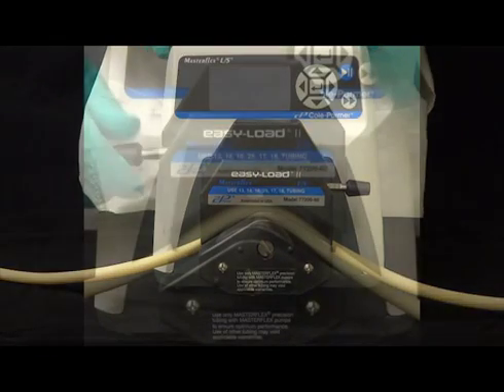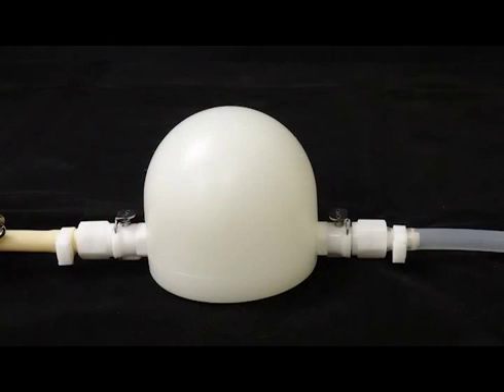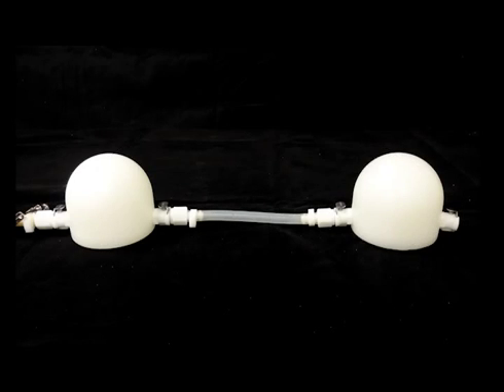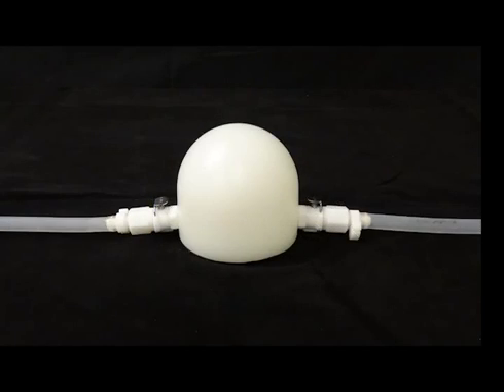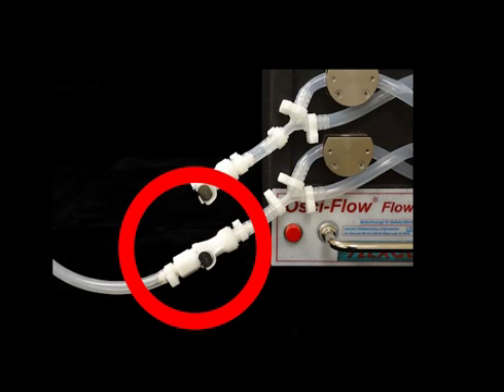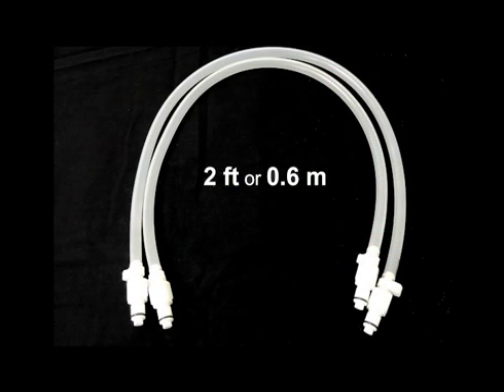When not doing an experiment, the pump head lever should be rotated to the left to eliminate pressure on the tubing. Connect the first pulse dampener to the second pulse dampener with a 3-inch-long segment of clear silicone tubing. Connect the second pulse dampener to the quick disconnect located on the bottom left corner of the Ossiflow controller with one of the 2-foot-long pieces of clear silicone tubing.